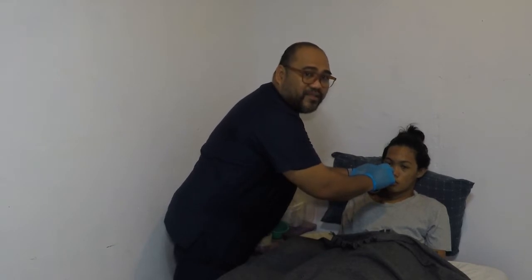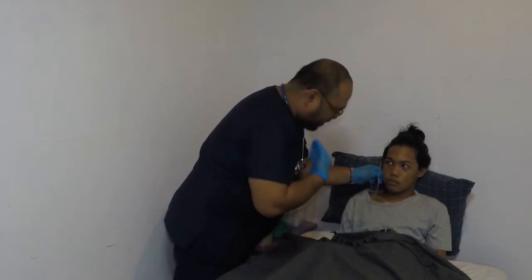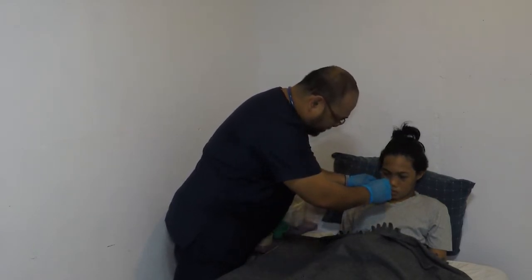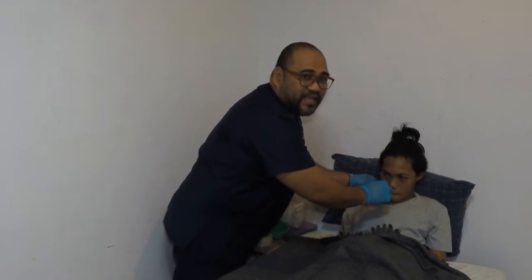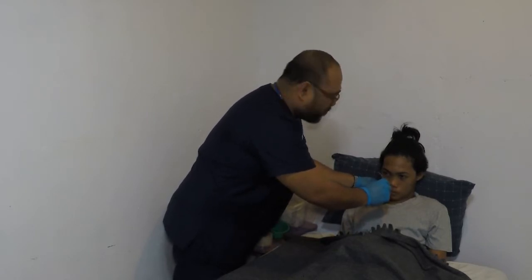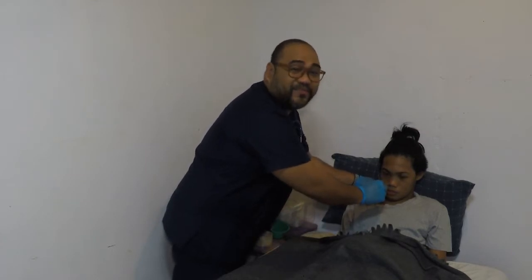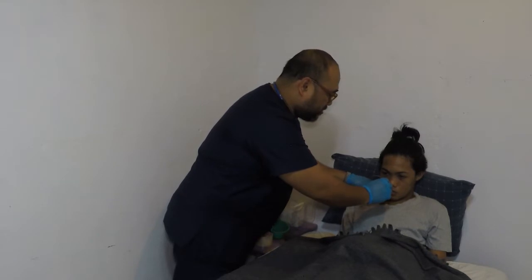The client may gag when the tube reaches the pharynx. So instruct the client to touch his chin to his chest. Sir, you can put your chin down to your chest. Your chin. And then encourage him to swallow even if no fluids are permitted. Then advance the tube in a downward and backward direction when the client swallows. Stop when the client breathes. If gagging and coughing persist, check placement of the tube with a tongue depressor and flashlight if necessary. Keep advancing the tube until the marking of the tape is reached.